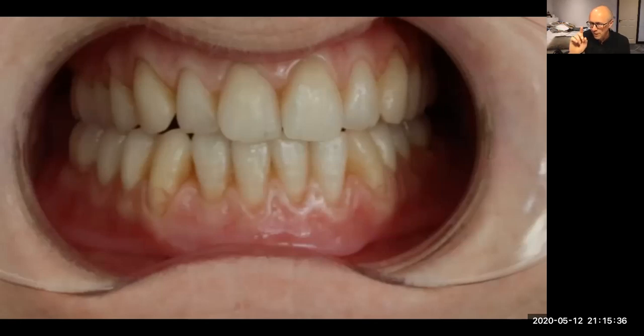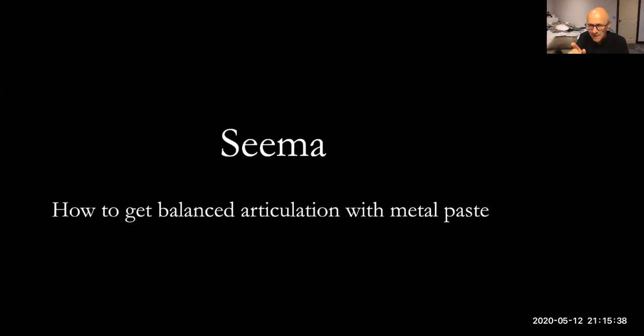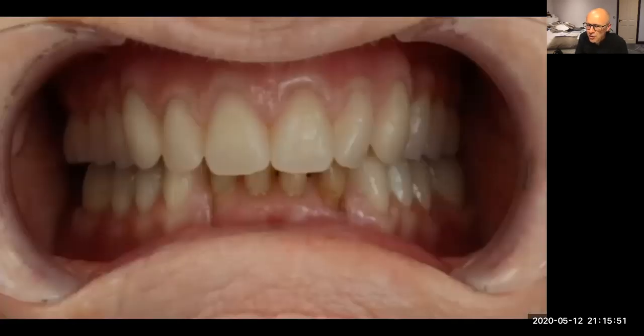But if you are desperate to get it, and Seema asked me this question, how do you get balanced articulation using this metal paste that I was talking about? Well, this is how I do it. I very, very rarely do it. It's like once every 2 to 3 years, I'll have a patient where I've not quite got the occlusion right, and it's annoying the patient because maybe the dentures are tipping.